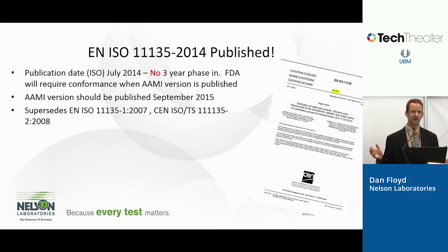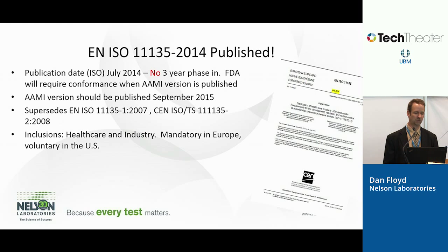This was a compromise between the US and Europe. Our position in the US is we like lots of guidance, so somebody who is not familiar with the standards can look at that, and the guidance will tell them exactly what they need to do to meet the standard. So it was a compromise that it would be a 2-part document. We'd get our guidance in as part 2, which is just informative, and the Europeans would have just the normative part of the document. Obviously they like to sell standards, so somebody came up with the bright idea, hey, let's merge it back to one like it was in the first place. It was supposed to be just editorial changes, but like with any document that goes through review, everybody tries to get in their 2 cents worth, and a lot of technical comments and changes got put into it as well.